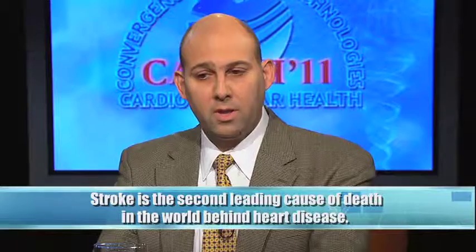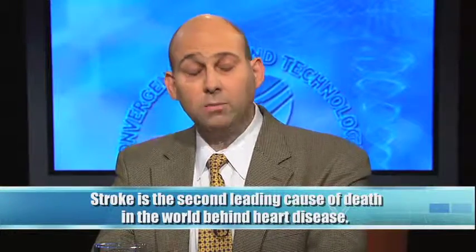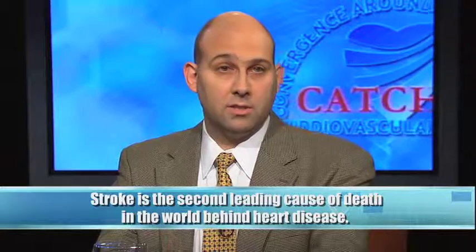Why do we treat carotid disease, and why might stenting be a reasonable alternative for those patients? Carotid disease accounts for one of the leading causes of death in the United States and a significant amount of cost and morbidity to patients as a result of strokes. And the vast majority of strokes are caused by cerebrovascular disease or disease within the carotid arteries. Traditionally, an open operation whereby we remove the plaque is how we treat that disease. But now with the advances in technology, we're able to use stenting techniques to minimize the invasiveness of the procedure to the patients and still get the result that we need by minimizing their risk of stroke going forward in the future.